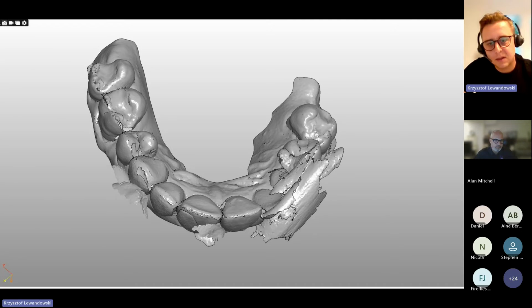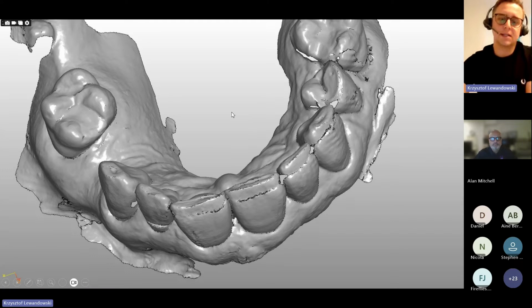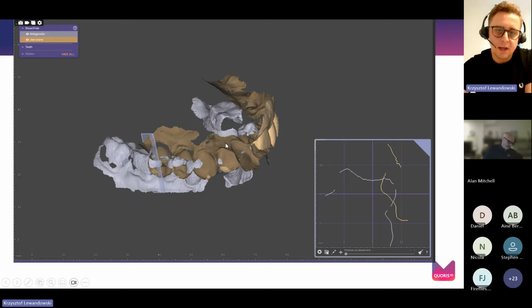But the problem will appear when the artifact is stitched into the STL. Another example of a maxillary case where we can see the double imaging on the occlusal surfaces. The next slide shows a case with multiple problems, because we've got an intersection between the upper and the lower jaw. In addition, the scan is incomplete with holes, and unfortunately, we are unable to accept those records.